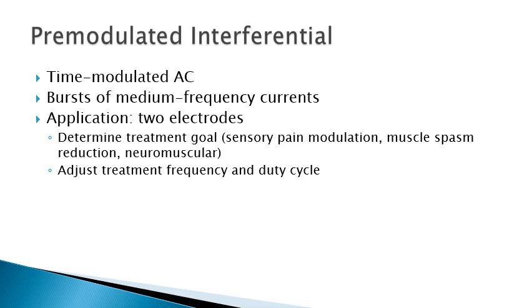So again, premodulated and interferential, they're the same type of waveform. Clinically, the reason you'd pick one over the other is if you only need two pads for the body part area, use premodulated. If you can use four, use the regular interferential.